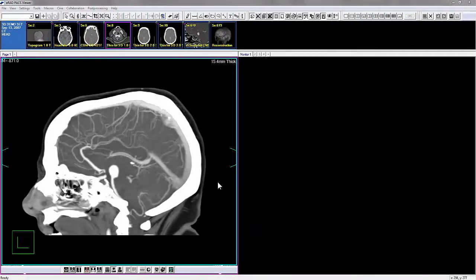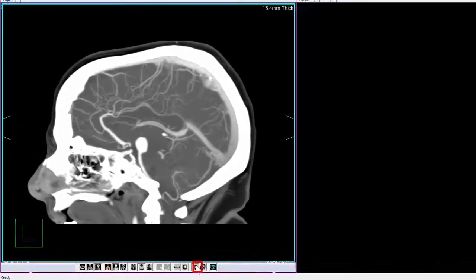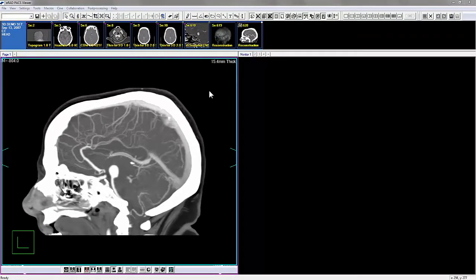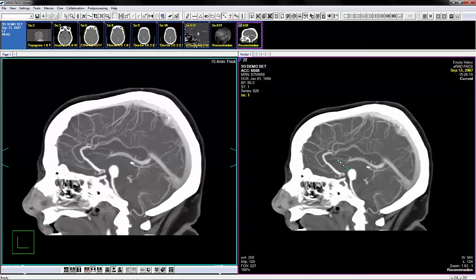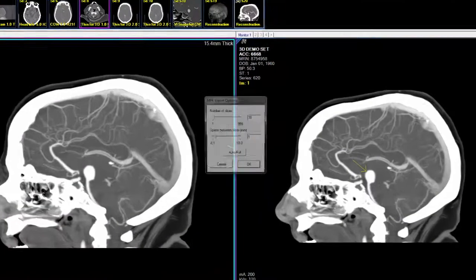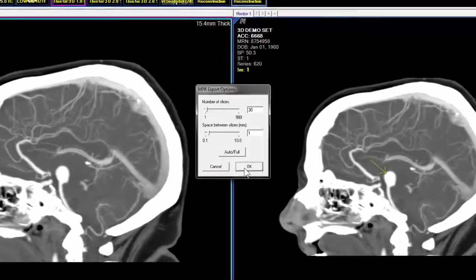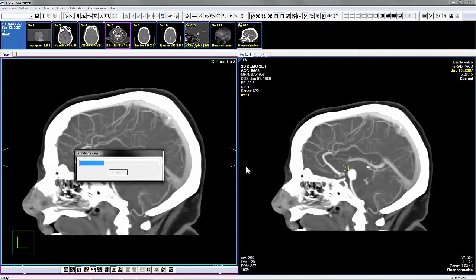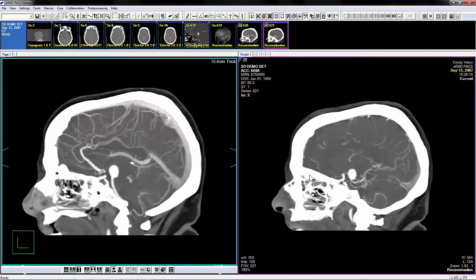To export a single image from the plug-in, select the export image icon from the toolbar. Please note that any annotations applied to the volume will not be part of the exported image; you may apply annotations to the exported image from the main viewer. To export a series, select the export series icon from the toolbar, set the number of slices and space between slices, then click OK. Exported images can be saved to the server for permanent storage or attached to the report as a key image.